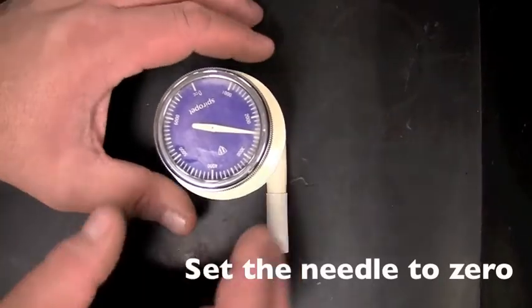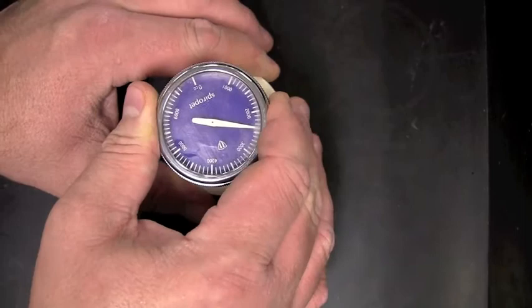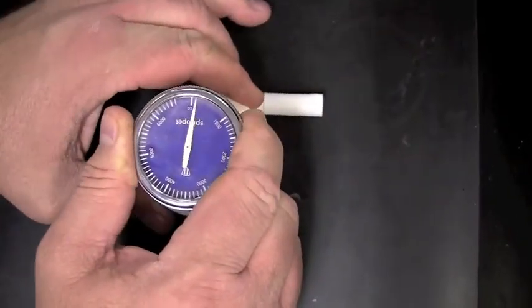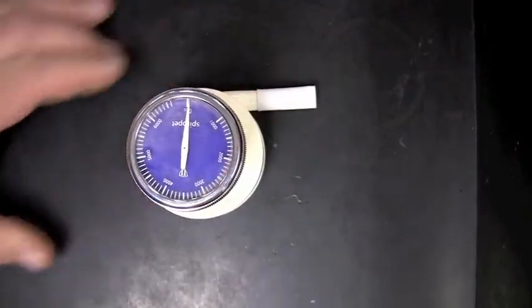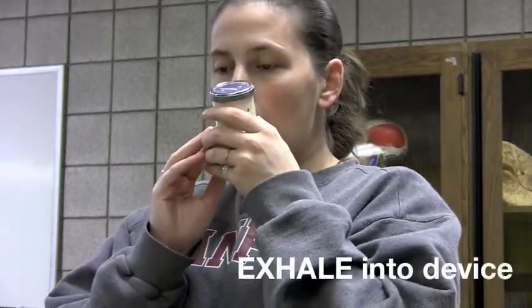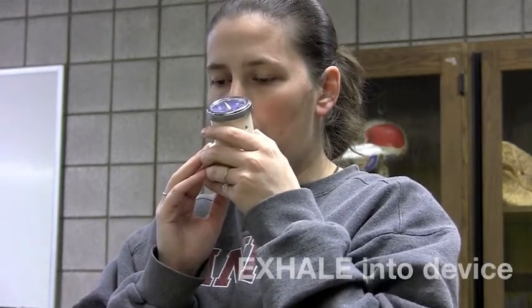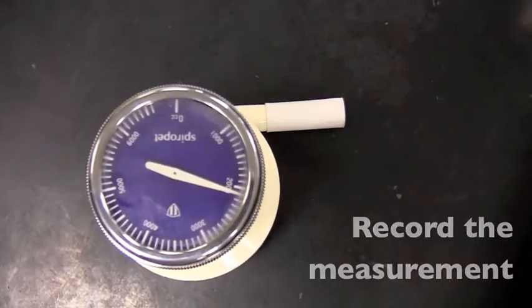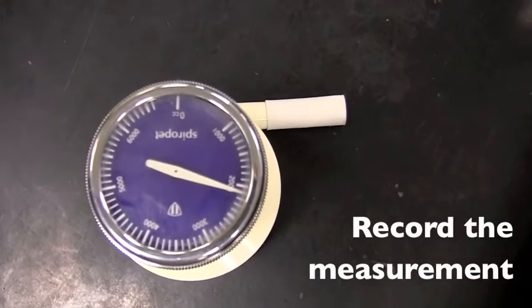set the unit to 0, exhale the desired volume of air into the spirometer, and record the reading in milliliters.